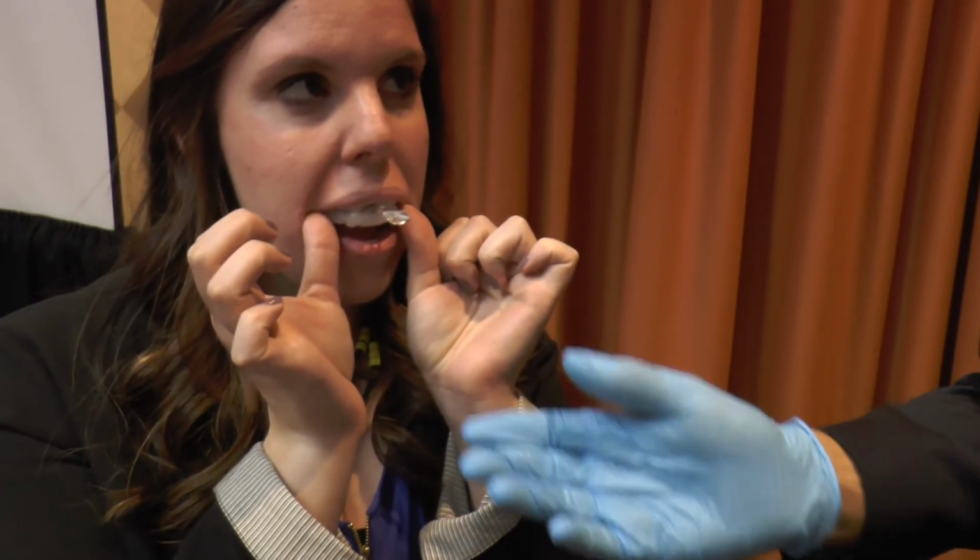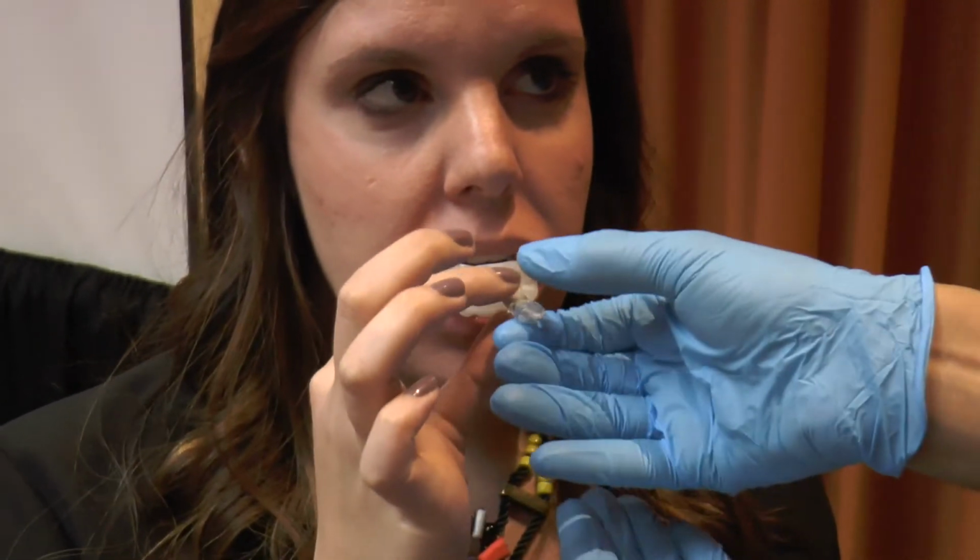So they're using their lower jaw as a fulcrum to disengage from the upper component. To remove the upper tray, if retention is very significant, take your fingers as far back as you can on the upper and push one side down completely. And by doing so, the opposite side will automatically disengage.